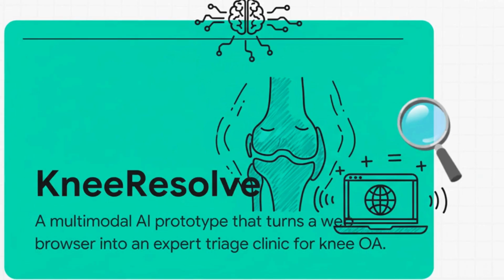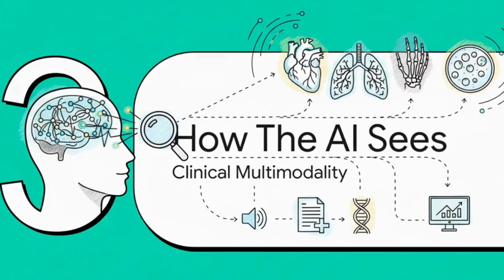It's a pretty advanced AI prototype built using Google's Gemini. But here's the thing, it's not some complex machine, it's not even an app you have to download. It just works, right there in a browser, turning pretty much any computer with an internet connection into this powerful screening tool for knee osteoarthritis. So how does this thing actually work?